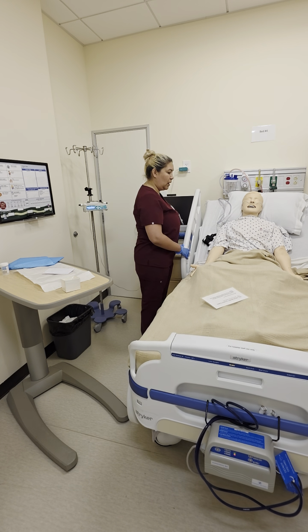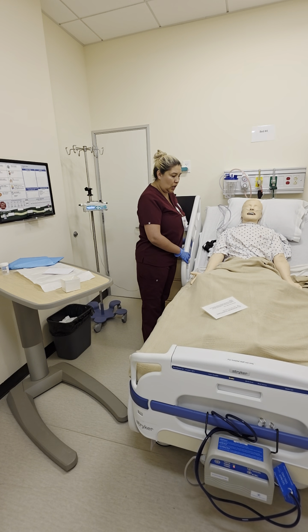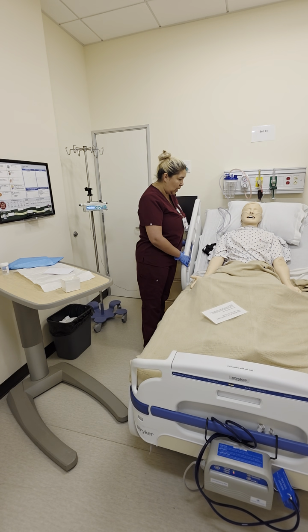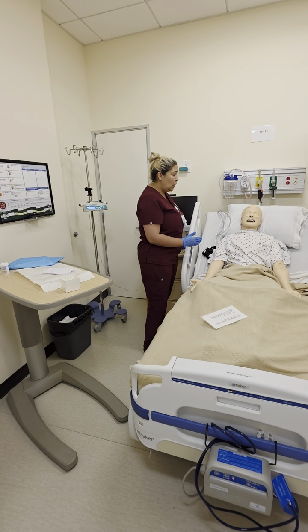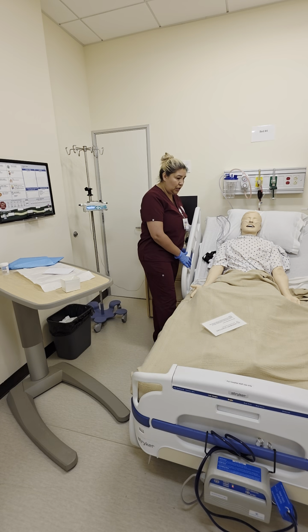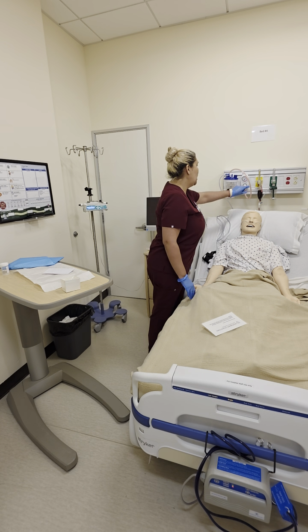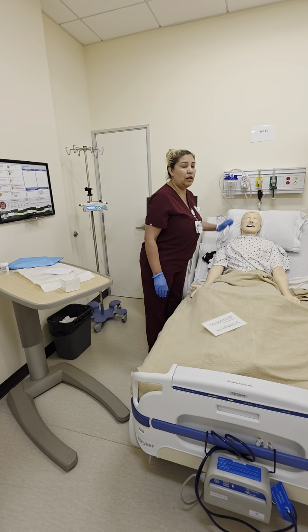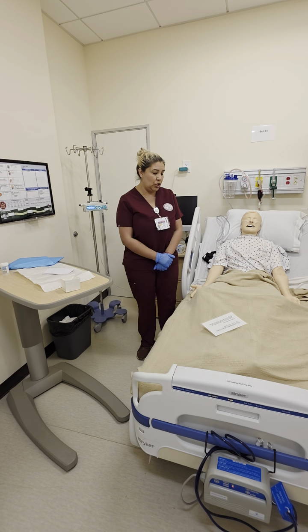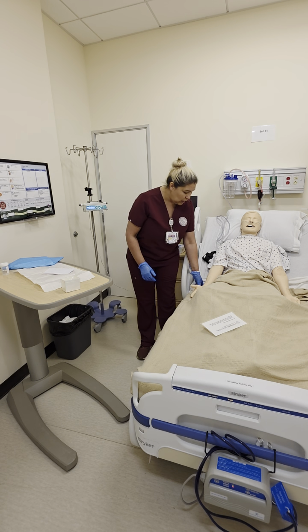Bring the bed all the way down. And then ask my patient how he would like to be positioned, whether he wants to stay up high. He said yes, so I will keep him there, make sure the bed is locked. Make sure that his oxygen is brought down to the order that the physician had, so it was 2 liters prior. So I will bring it down to that.